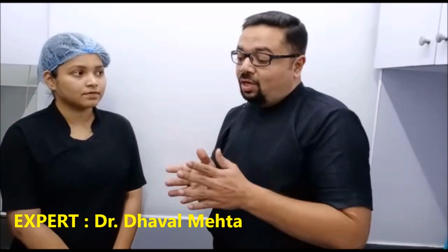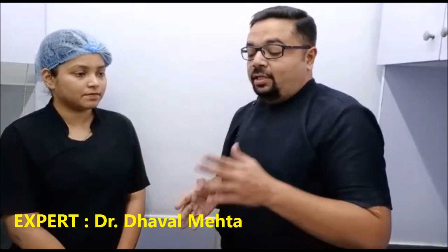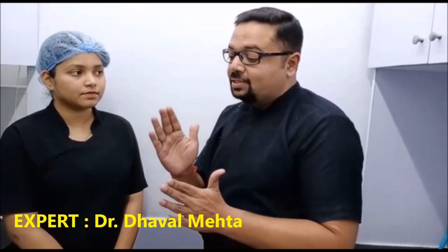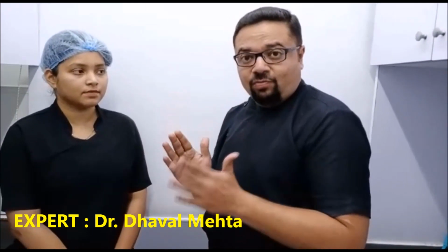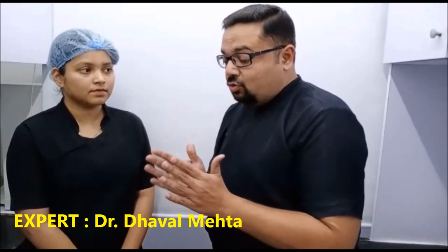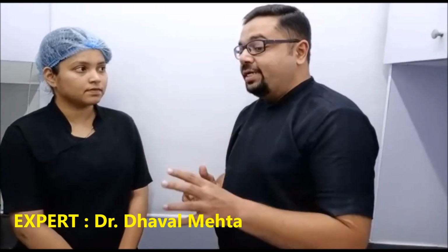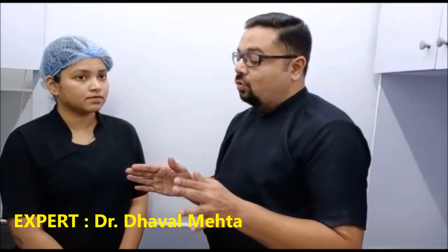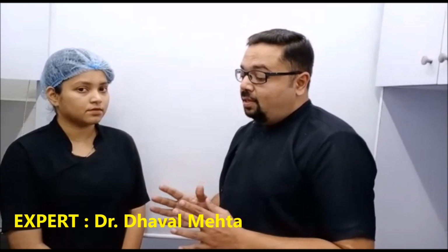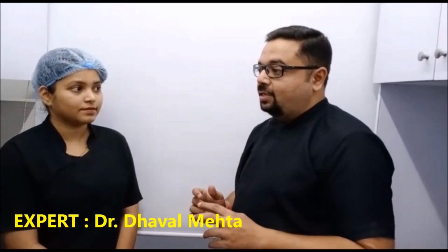Once you follow the lingual plate placement, which is always mandatory as you know, there is a high chance of a gap between the implant surface and the buccal wall. That distance is known as the jumping distance. If it is less than 2 mm, then you can still take a chance without grafting and close the site. But if it is more than 2 mm, then that distance may not be covered by the osteoblasts. So you have to graft the site.